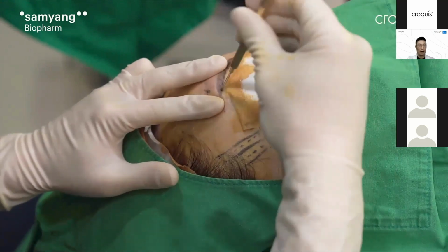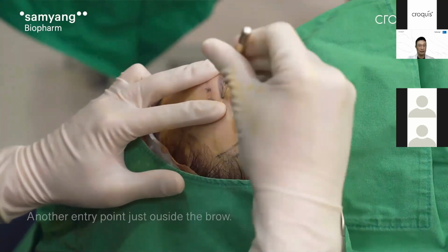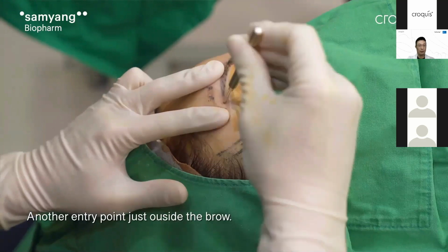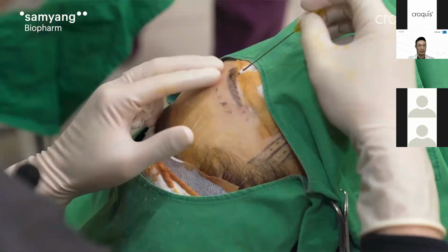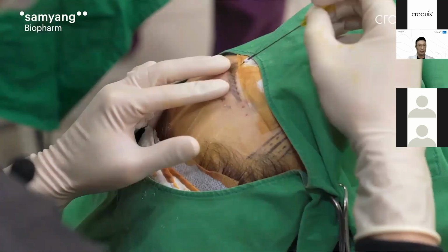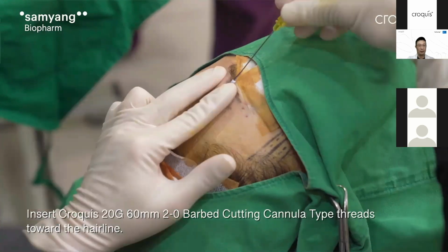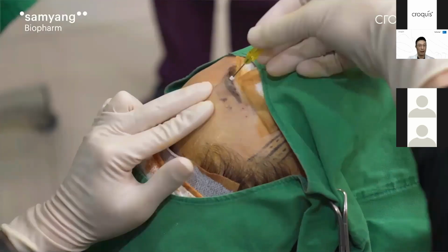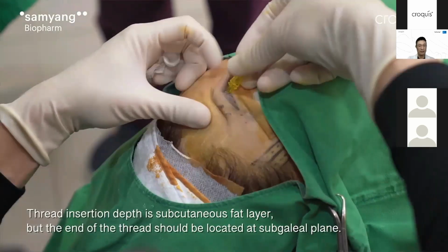I'm using an awl. It's better than an 18 gauge needle because it can produce less PIH or less scarring. Because these days, patients are very upset after a small scar or PIH after treatment. So it's better to prevent.